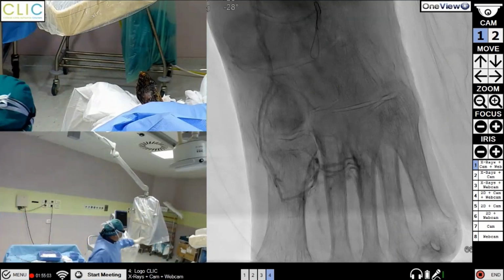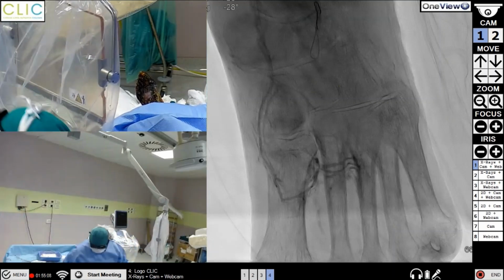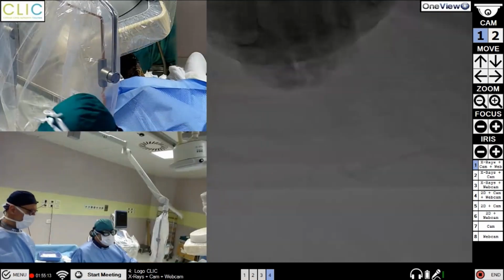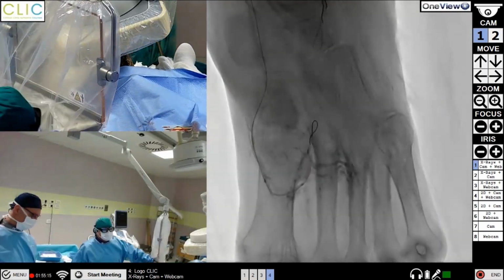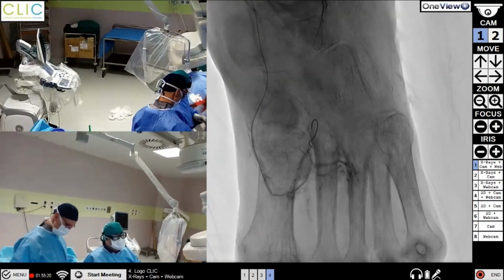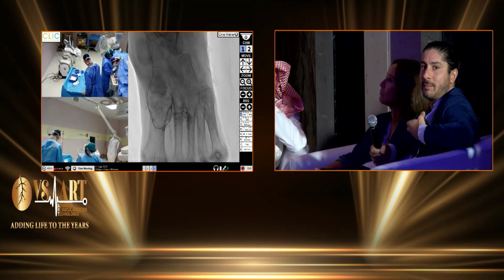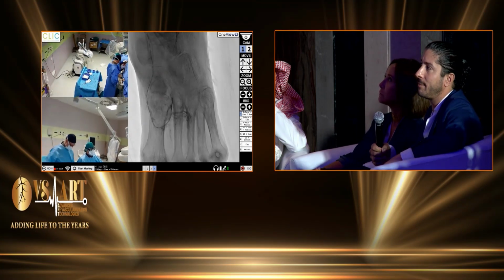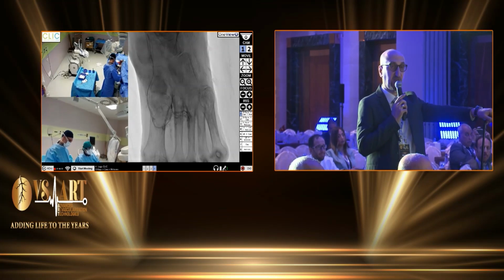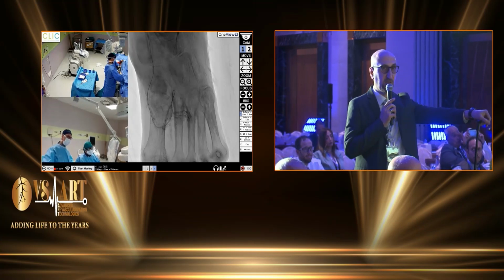Absolutely, but we know. There is a comment from Bruno. No, there is no comment from Bruno. Sorry. I have a question for you, Mariano, and for all our panel. All we are looking for in such cases is the basal compliance, and we have a long dissection here in the anterior tibial artery. So is this going to be a target lesion revascularization after a short time with this long dissection? What do you think?